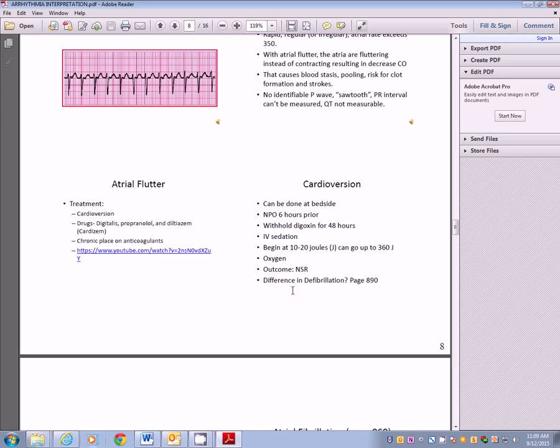Defibrillation is indicated for patients in ventricular tach or VFib when they've lost consciousness and CPR is in progress. You can set it at about 360 when you're doing defib, and then evaluate the rhythm after each shock and continue CPR, hoping that the patient comes back.